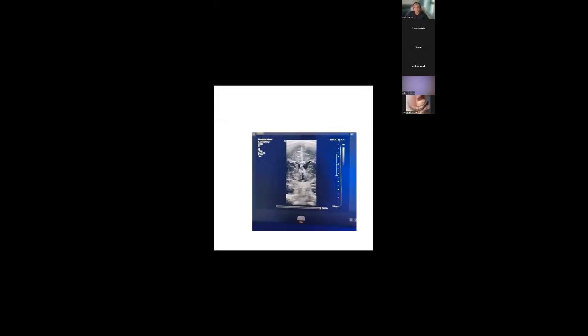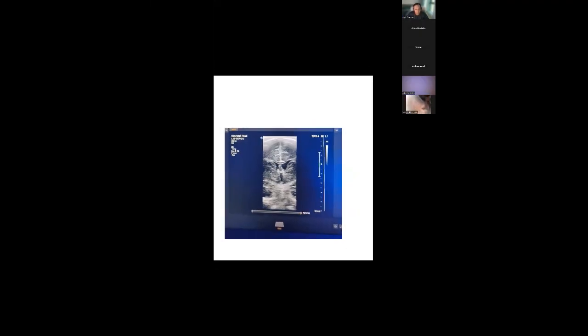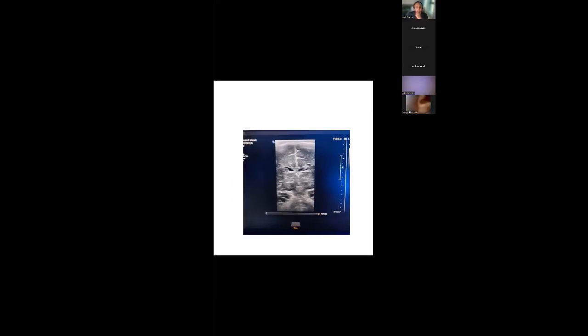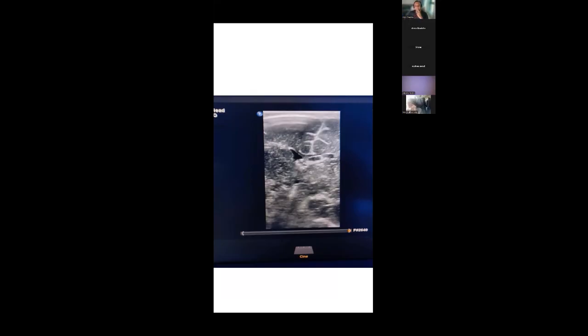Just a baby with no risk factor, only the mother is hypertensive, and I just want to learn how to do this with the full-term baby. After that, you can see in the left side, the left ventricle, also, but I was confused what it is. Again here, on the left side, it is seen.